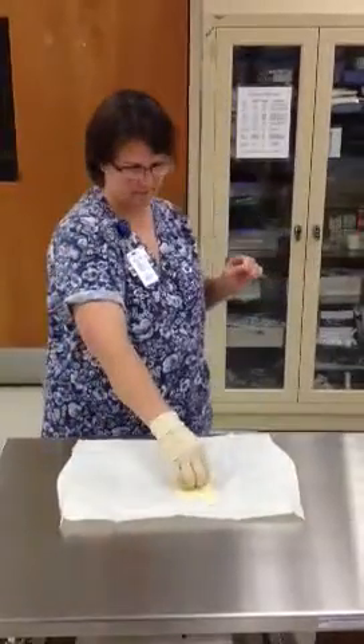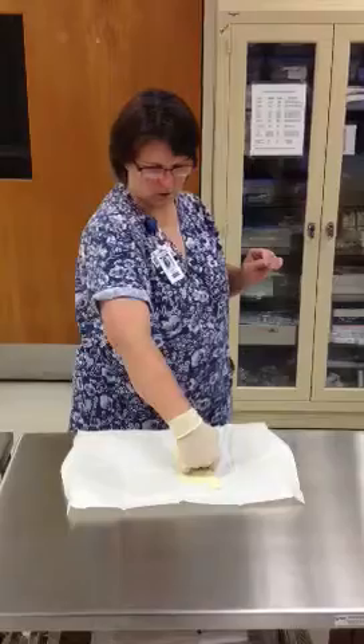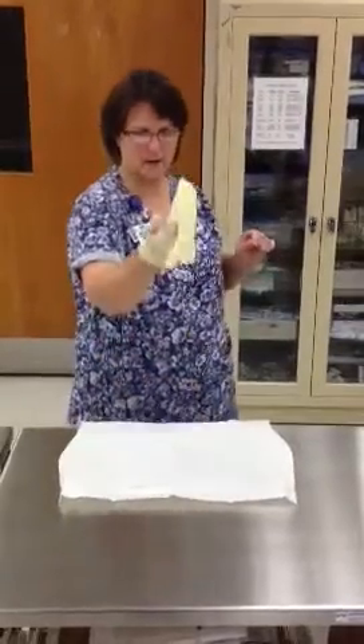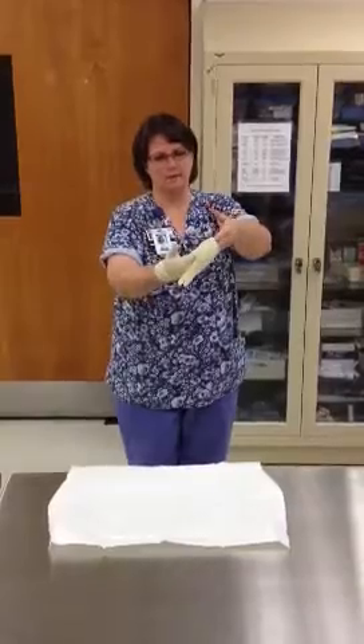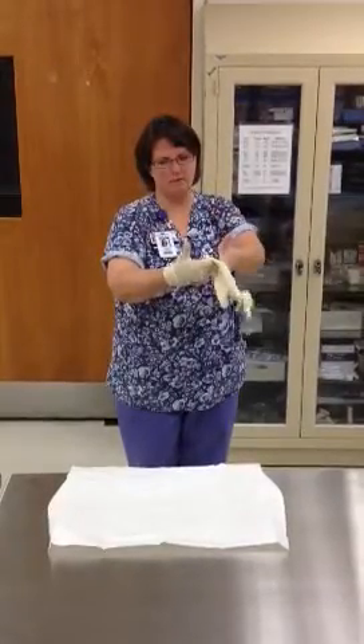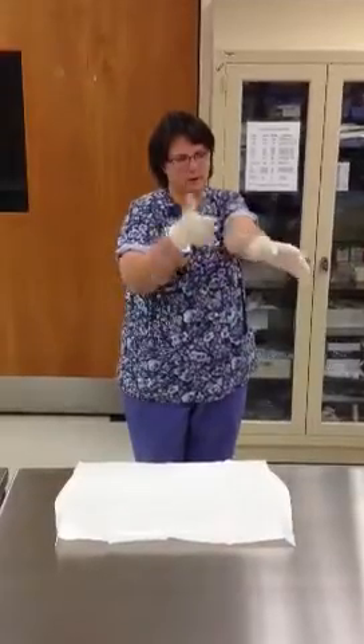For the second glove, reach across and slide your four gloved fingers underneath the cuff, pick it up, and step back. Put your hand inside of the glove, making sure that the fingers of the glove are pointed down toward the floor, and pull it on.